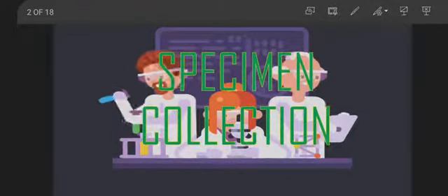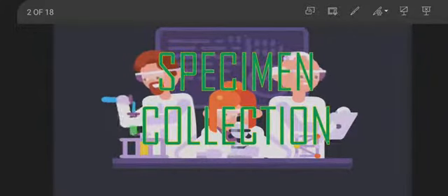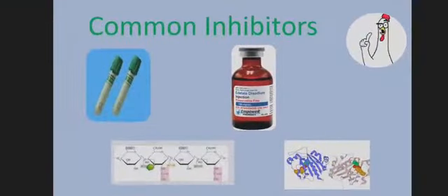storage and processing. Before we proceed to the sample collection used for SARS-CoV-2, we must consider the common inhibitors found in the molecular diagnostic laboratory, which are heparin, disodium EDTA, acidic polysaccharides, and nucleases. These are present in the molecular laboratory, which may degrade nucleic acid, may inhibit reverse transcriptase and DNA polymerase, and may inhibit enzymes.